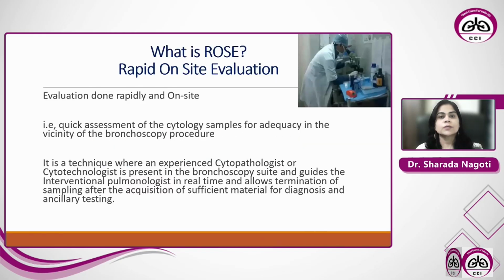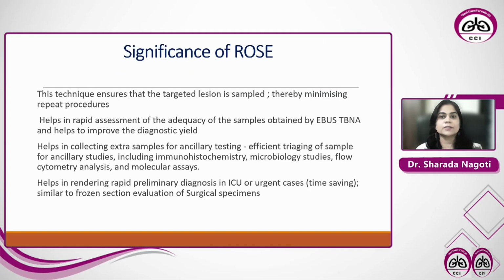So what is ROSE? ROSE is rapid on-site evaluation. That is, evaluation done rapidly and on-site. That is, quick assessment of the cytology samples for adequacy on-site, that is in the vicinity of the bronchoscopy procedure. It is a technique where an experienced cytopathologist or cytotechnologist is present in the bronchoscopy suite and guides the interventional pulmonologist in real time and allows termination of sampling after the acquisition of sufficient material for diagnosis and ancillary testing.